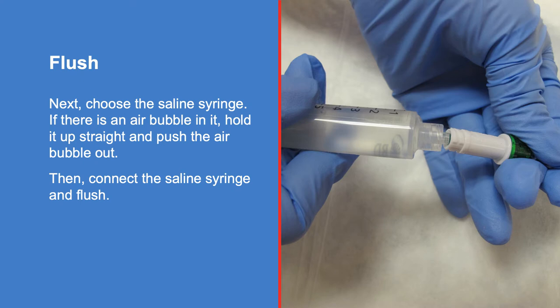Next, choose the saline syringe. If there is an air bubble in it, hold it up straight and push the air bubble out. Then connect the saline syringe and flush.